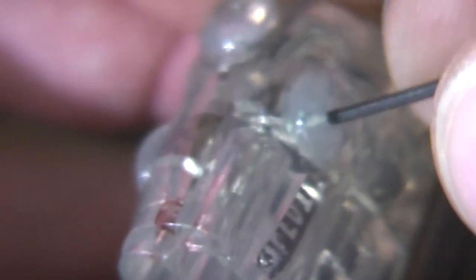These are actually screw terminals, and there's some soft silicone here that you can actually get an Allen key through to actually get to the screw. Not sure if we can focus on that. You might actually be able to see the screw at the bottom of that cavity if I just unscrew it.